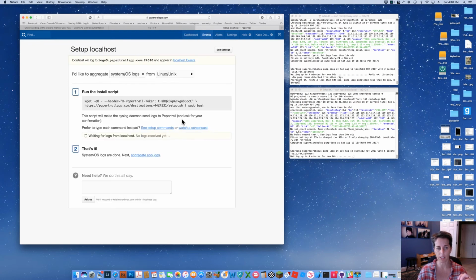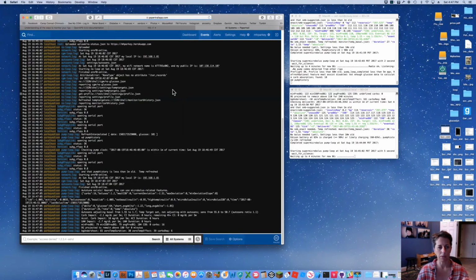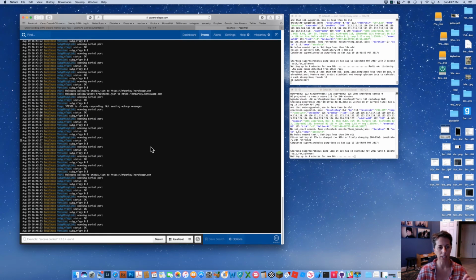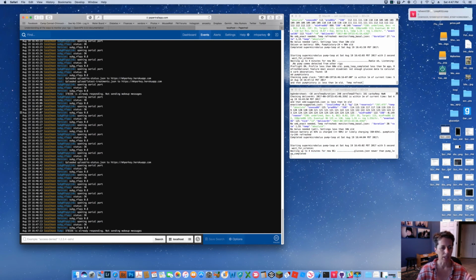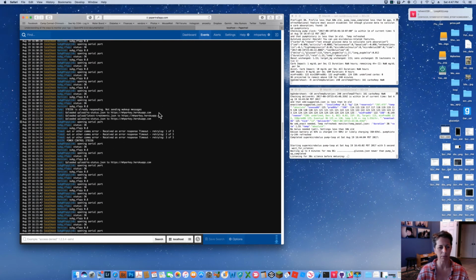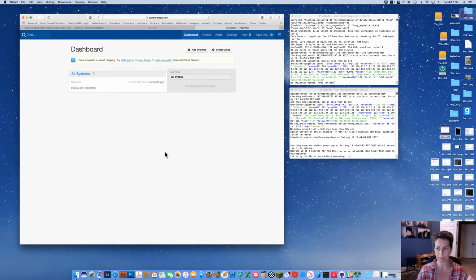If you click on localhost, a lot of times it uploads. On this particular one, it's not uploading anything worthwhile because I have it turned off. But if you were loading, say for example, I'm going to go to hers. If you click localhost and see these people, mostly what you see is a whole bunch of version and the RF spy things, and it's really not that useful. So I just wanted to kind of show you. Localhost has some stuff, but it's really not worth looking at. So going back to my rigs here.